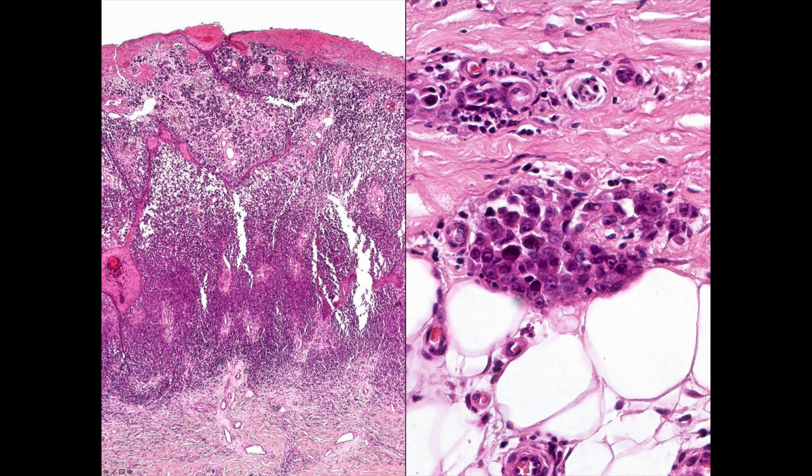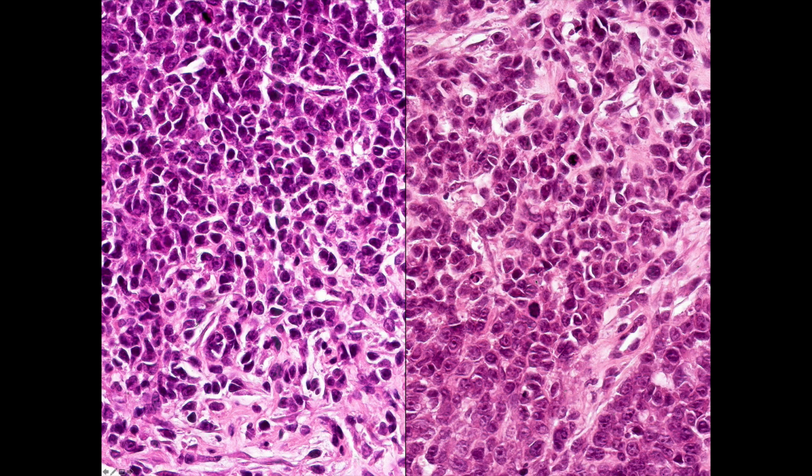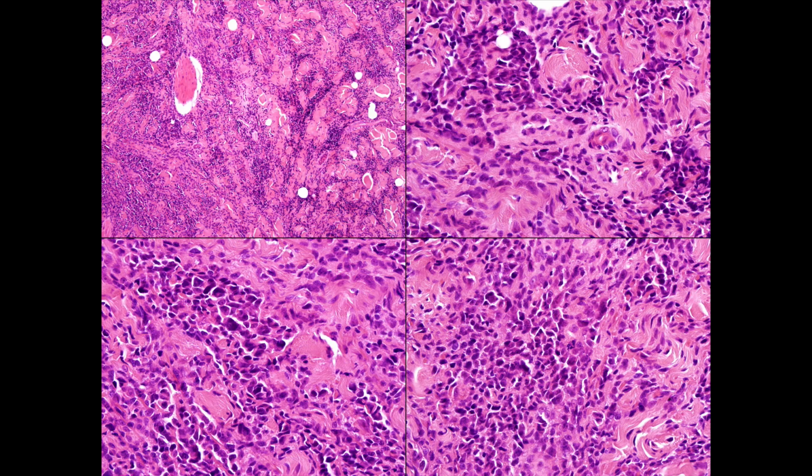on the right, this shows you the extent of the lesion just nudging down into subcutaneous fat. And here are two more fields. And again, in the absence of junctional activity or in the absence of any immunohistochemistry, one would be hard pushed to call this necessarily a melanoma, although melanoma obviously comes into the differential diagnosis. And here's another one. This is probably even more difficult.